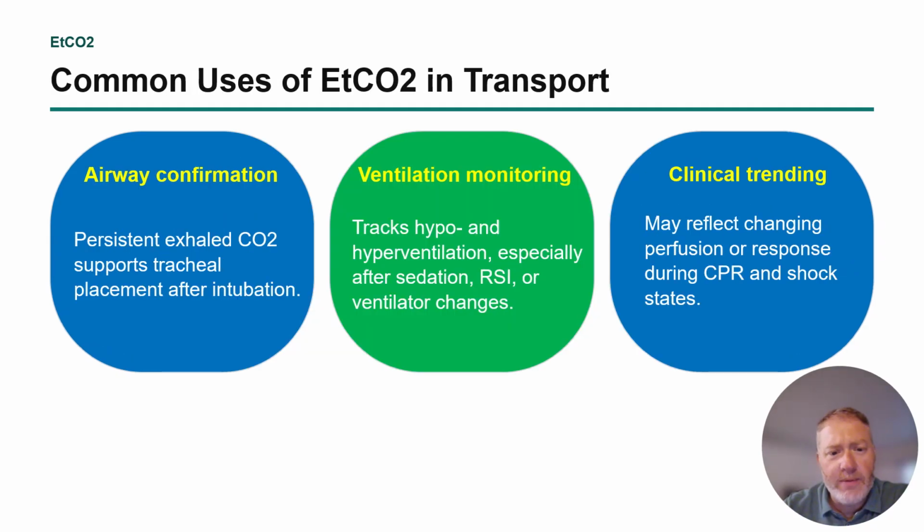The three most common uses of end-tidal CO2 in patient transport are airway confirmation, ventilation monitoring, and clinical trending. So airway confirmation, especially for anybody with an airway adjunct, especially if they're just intubated. Persistent exhaled CO2 supports tracheal placement after intubation, of course. So your purple is going to turn yellow or gold, yay for yellow.